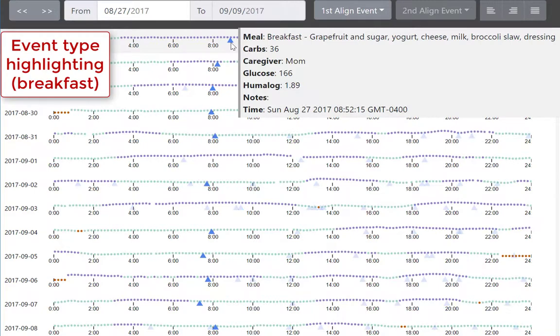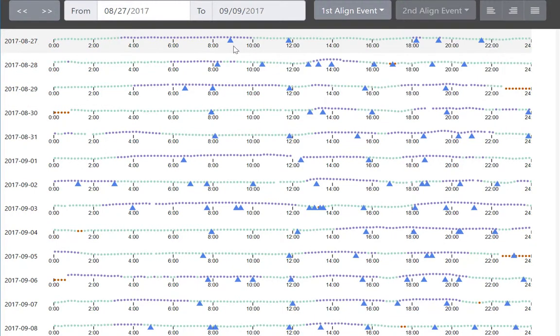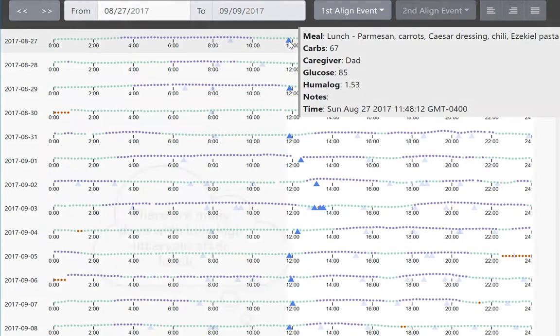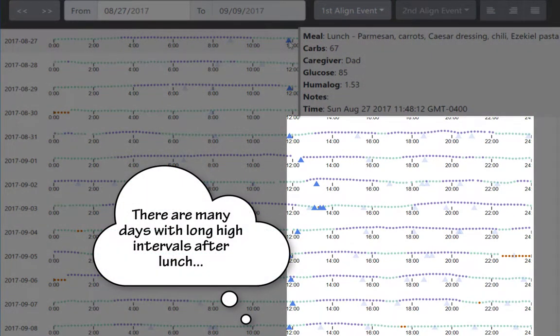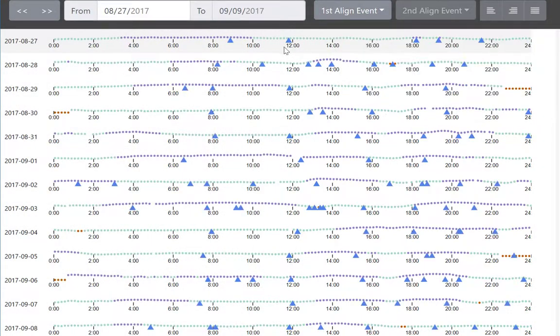Mousing over an event highlights events of that type, in this case breakfast, and we see how they're distributed over time. Mousing over the next event highlights all lunches. The purple dots after lunches here indicate long, high blood glucose intervals that we want to eliminate.